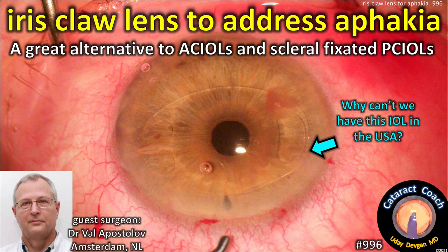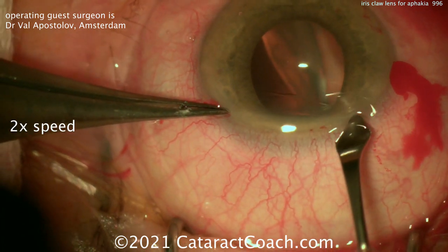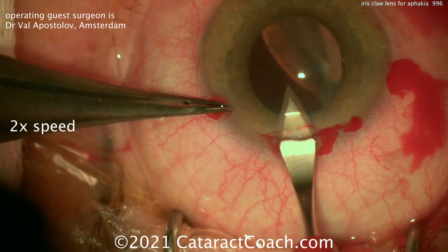CataractCoach.com — iris claw lens to address aphakia. It's a great alternative to AC IOLs and also to scleral fixated PC IOLs. Here's a patient. Our guest surgeon is Dr. Val Apostolov from Amsterdam in the Netherlands.